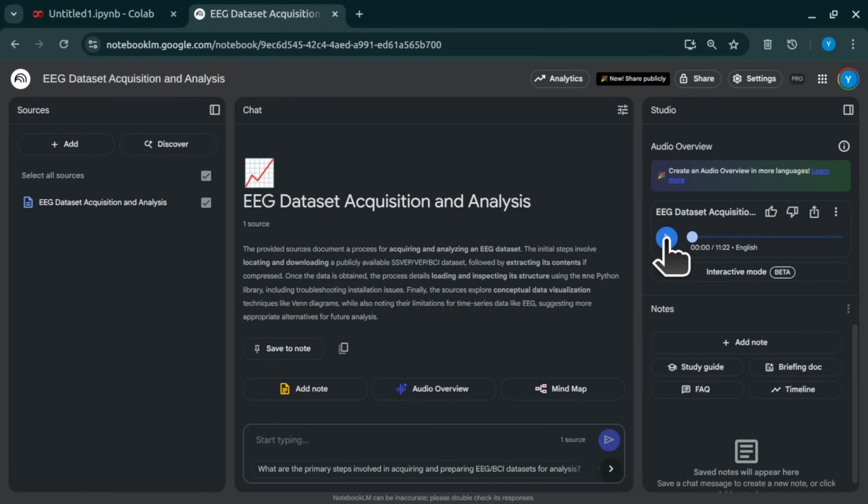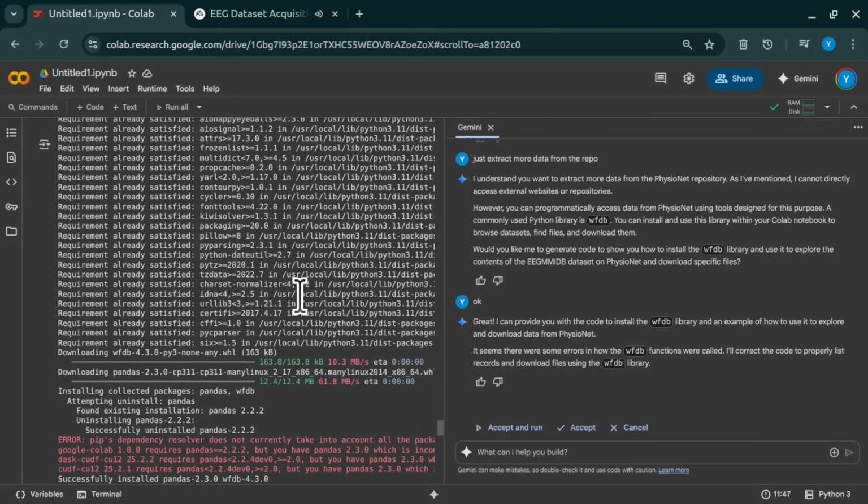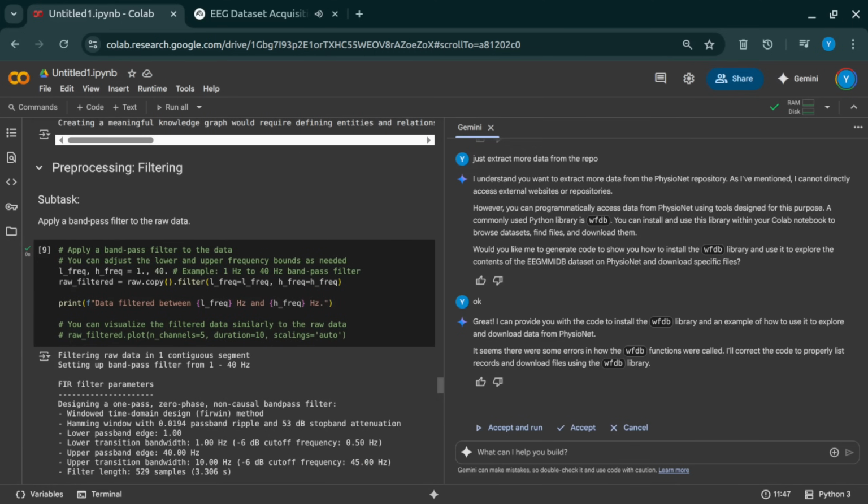It's only 11 minutes. Have you ever really peered into the intricate dance of electrical signals that is your own brain? It's pretty fascinating stuff. Today, we're taking you on a hands-on deep dive. We're looking at the practical side of working with raw brain activity data, the actual foundation of brain-computer interfaces, or BCIs. Yeah, our mission here is really to walk you through those first crucial steps.